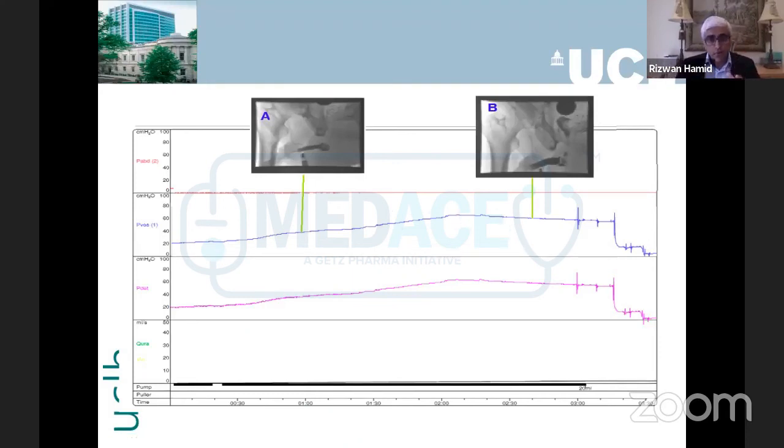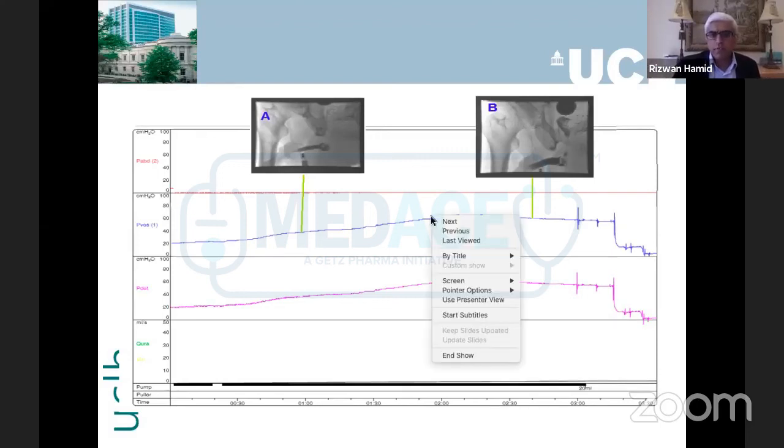So this is important. On the other hand, if it leaks at 60 centimeters of water, and probably that is an overactivity, then you need to have this discussion with the patient that maybe the sphincter is working all right. It is just that the pressure in the bladder is so much, 100 centimeters of water, which we can, I think probably we have got the next slide.